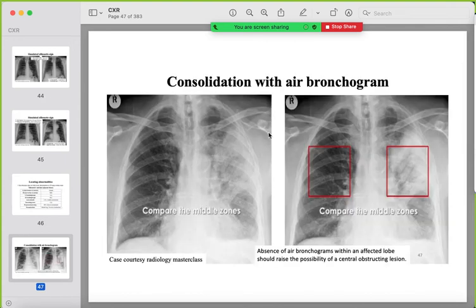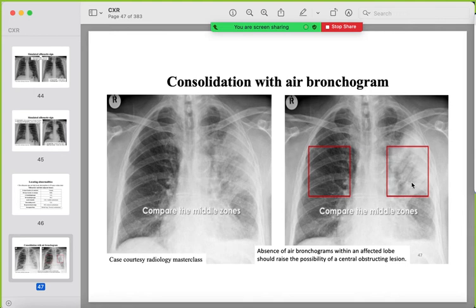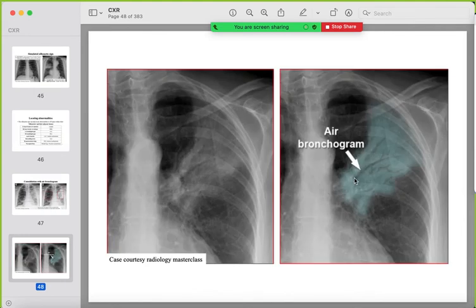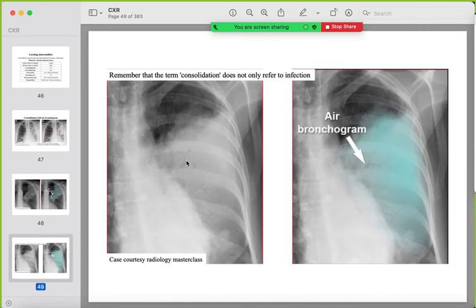The air bronchogram sign: when alveoli are filled with fluid — due to pus, hemorrhage, or heart failure — the bronchi and bronchioles still contain air, so you can see alveolar opacification with patent airways inside. This is the air bronchogram sign. It is absent when the opacification is due to a mass lesion rather than consolidation, making it an important sign to look for in every opacity.